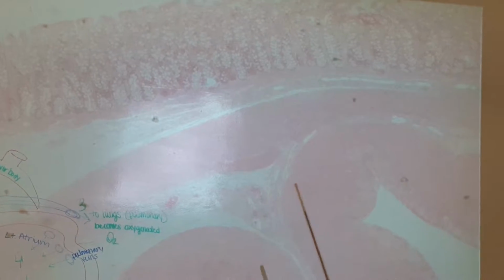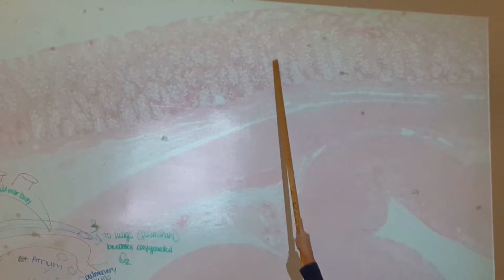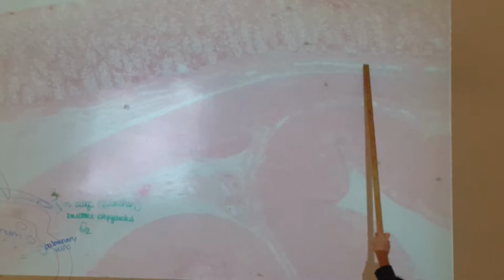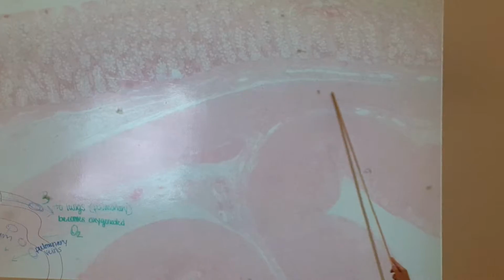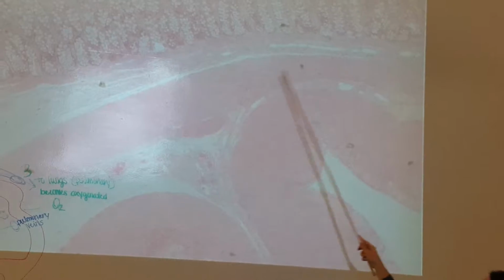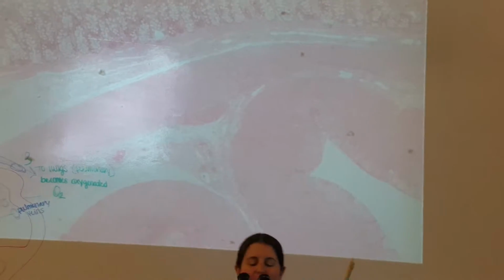Where's the intestinal cells? Any of these circles? Like big circles. Okay. Giant circles. Now in this one, again, it's kind of curved over. So the submucosa is not really that wide until it gets right here, and then it widens out. So that makes this the muscularis externa circular, muscularis externa longitudinal.